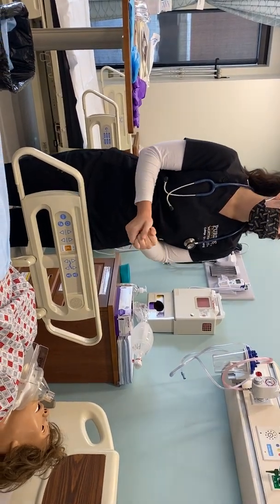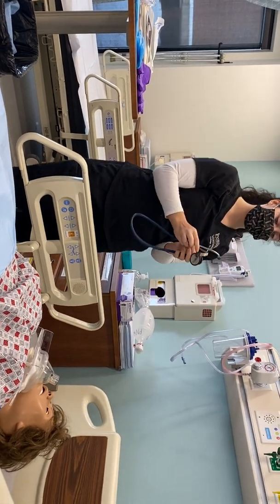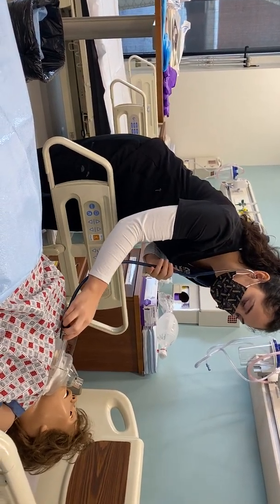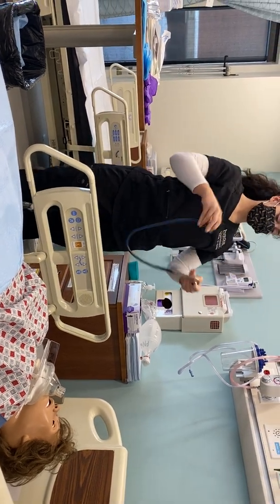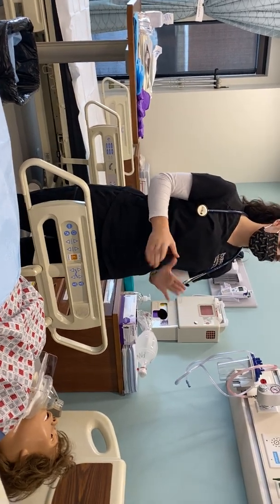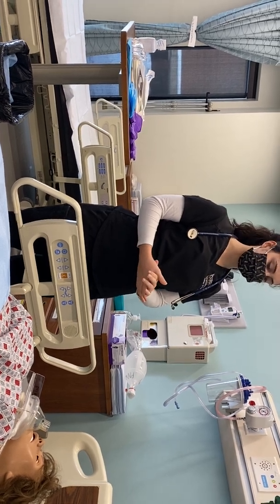Thank you. Okay. And also, I'm going to auscultate. I'm just going to listen to your lungs to confirm the doctor's order. Okay. It does sound like you're going to need a suctioning, and along with that, it will come with care. So that verifies the doctor's orders. And are you in any pain? Okay. You're not in any pain, so we won't need any medication for the procedure.